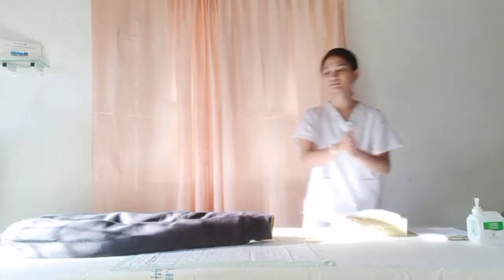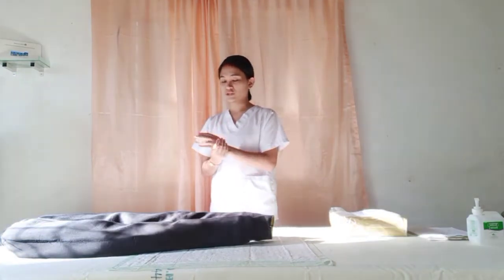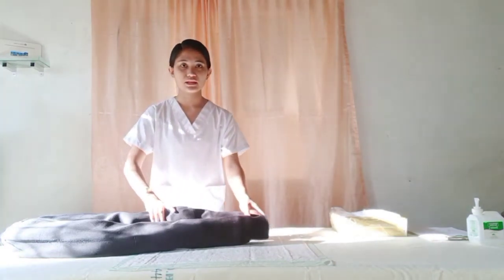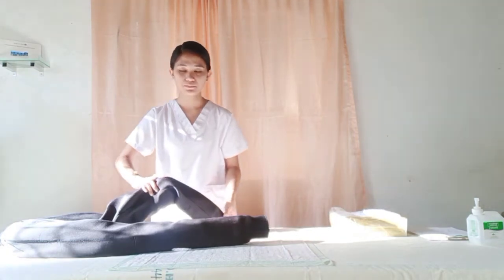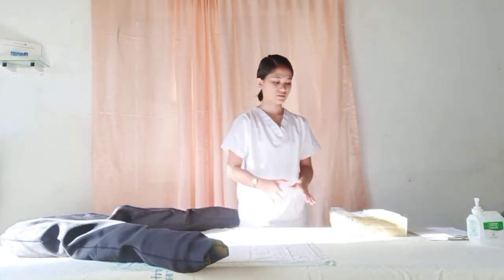Again, wash my hands. Okay, so Mrs. Cruz, I need you to position in a lithotomy position. In positioning the patient, you have to position her in a supine position like this, and then flex her legs, her knees up, with her legs at least 2 feet away from each other. Okay, so assuming that she is already in a lithotomy position, I'm now going to start the procedure.